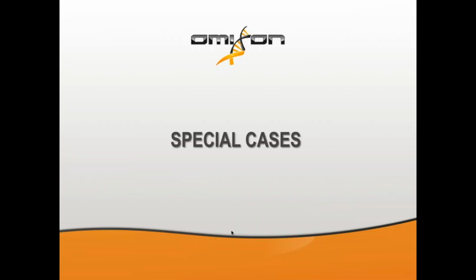So that was all from a technical point of view. And now let's move on a bit and review a few special cases of samples with challenging results and interpretation. We have prepared a selection of samples that our customers encountered during their routine work, and I would like to use them to show you some features and tricks in HLA Twin.